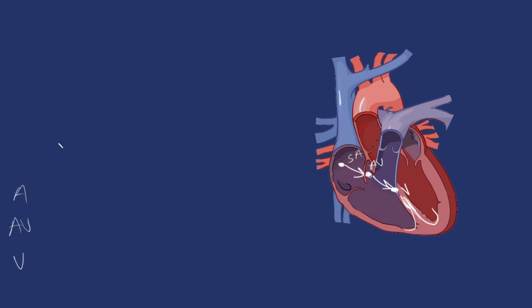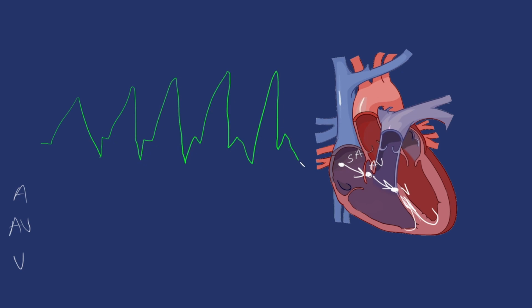So this next one, we'll break this down again. We can see our QRS, very big. We can break these down the whole way through. So these are quite large, but now here's the issue. They're wide QRSs, so are these coming from the AV node? Not particularly in this case.